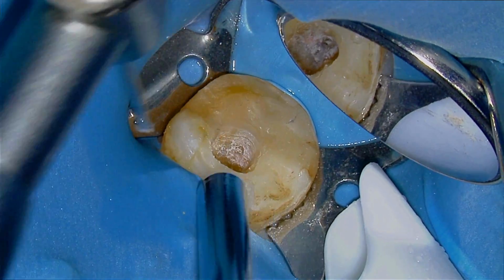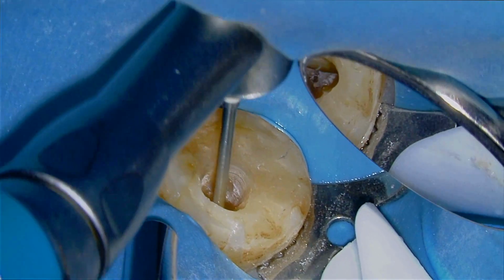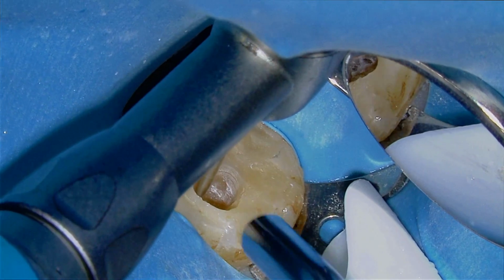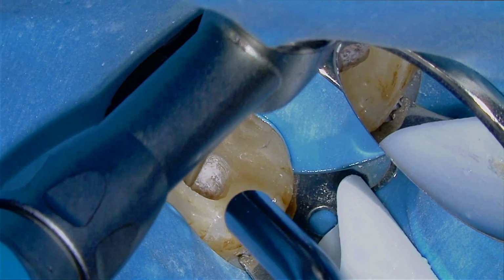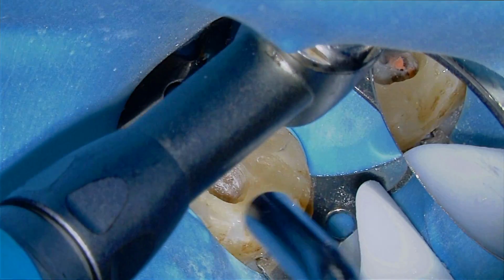I'm going to get into the orifices a little bit, and one of the tips that I've been taught is to have my dental system blow air while I'm doing any type of slow speed work. So I'm going to trough left to right. Well, it is left to right. Buccal to lingual. And just so you can see the gutta percha starting to come out.